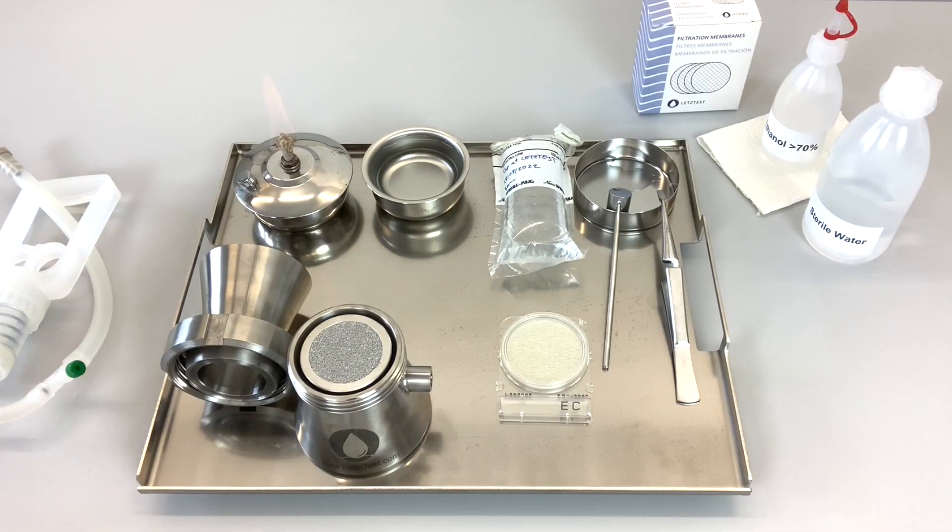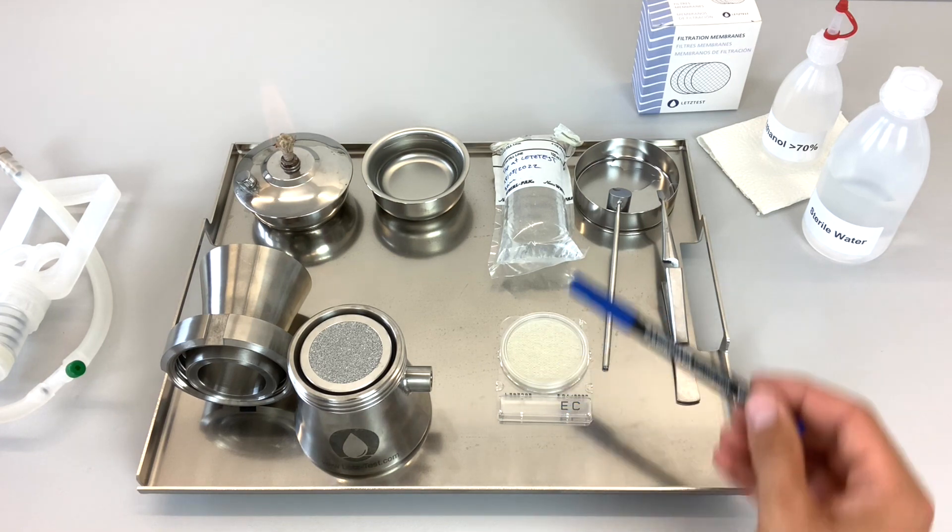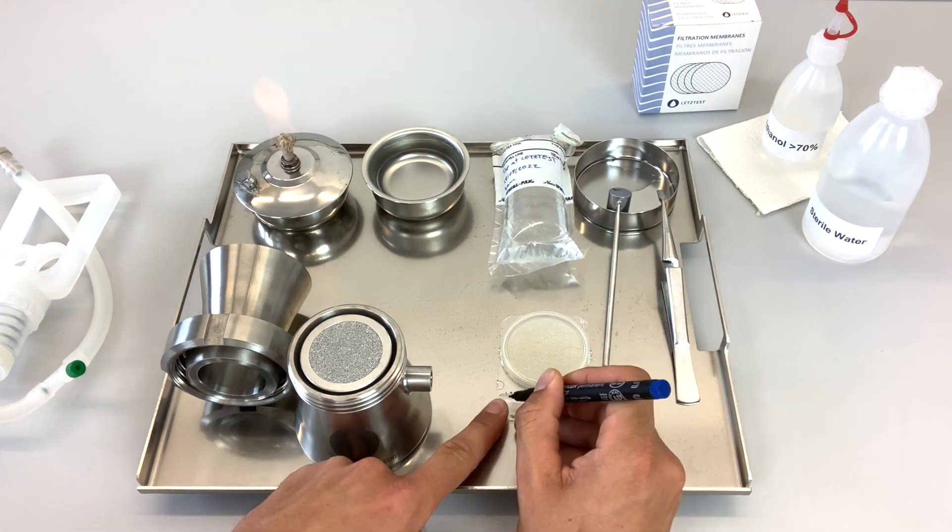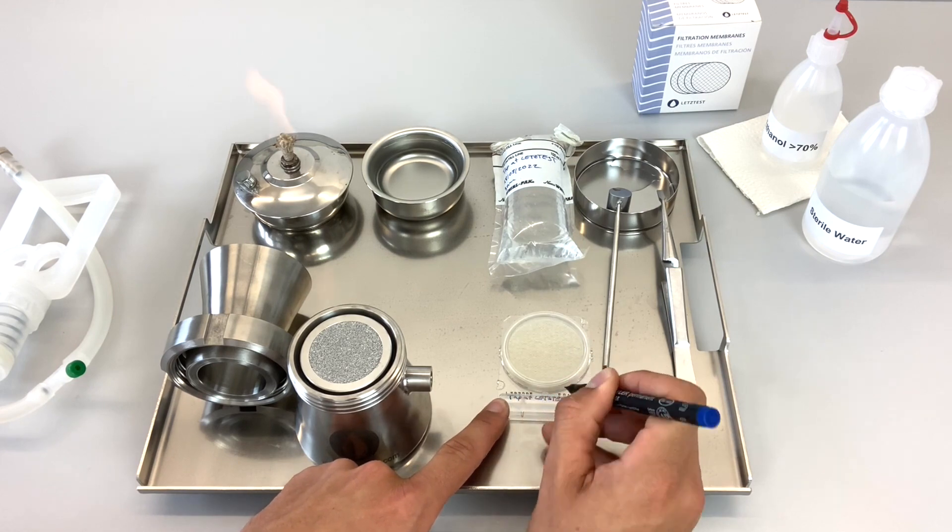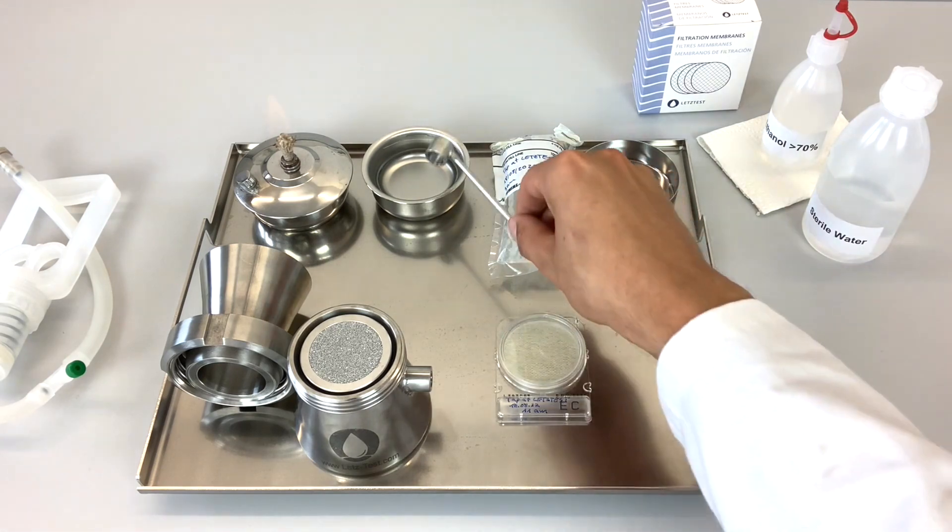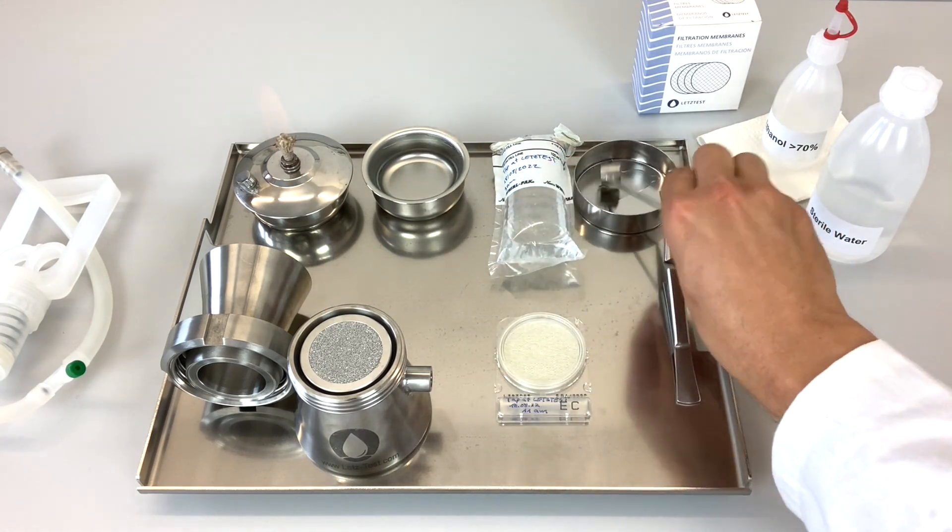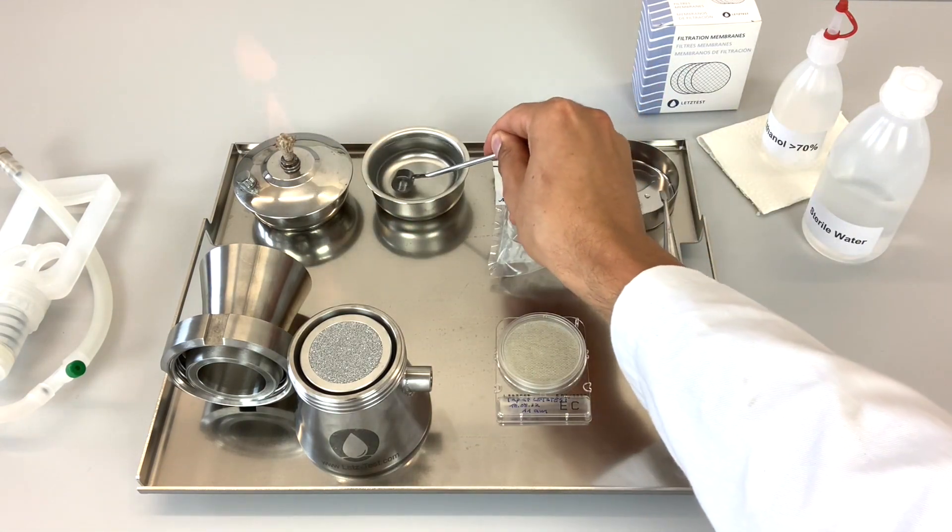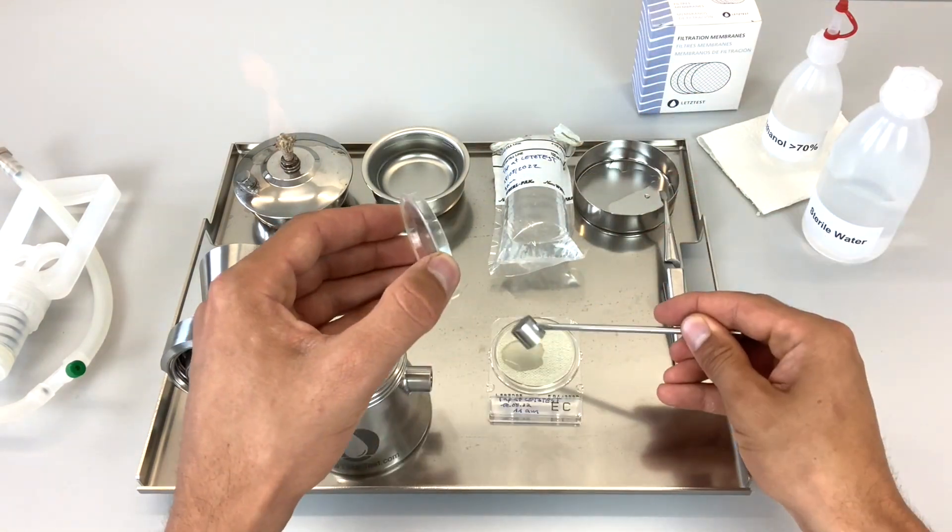As a first step, the tester can now label and then activate the dry chromogenic media plate. Label it with the information from the corresponding sample bag, but indicate the date and time of testing. Now use the one milliliter stainless steel spoon to activate the plate with one milliliter of sterile water.